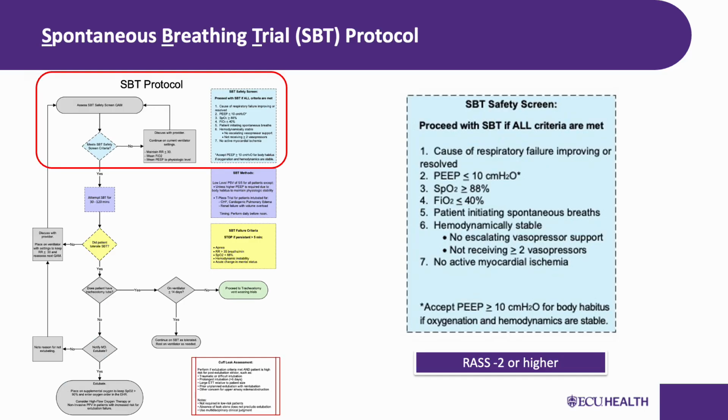All right, team, now we're getting into one of the most important protocols and one that has some significant workflow updates. This is the Spontaneous Breathing Trial or SBT protocol. Pay close attention here because this involves a change in your daily practice. Let me start with a big headline.